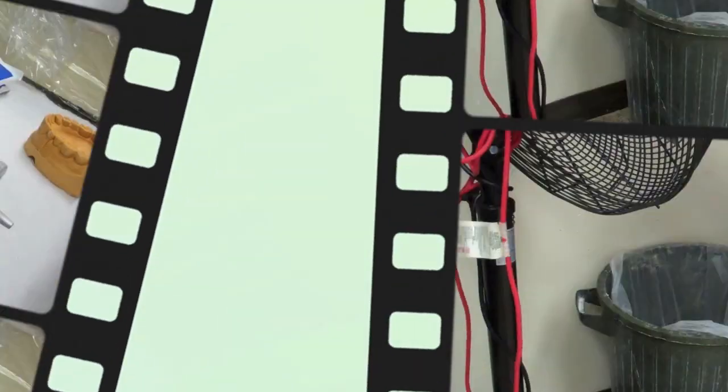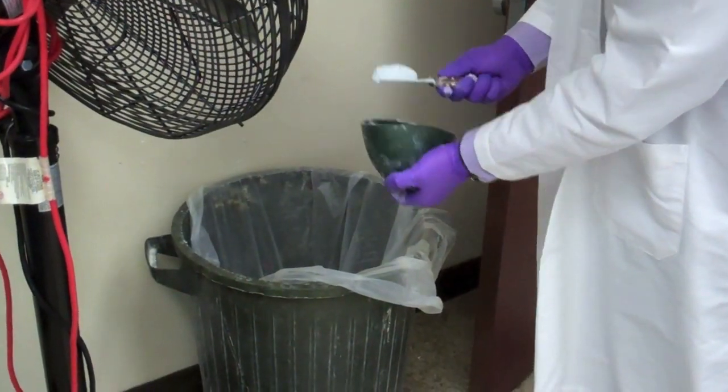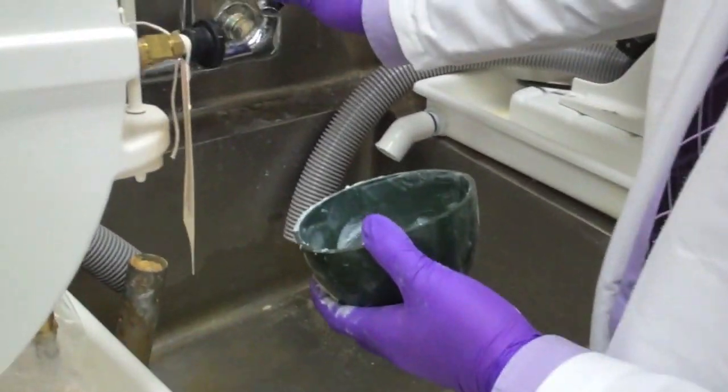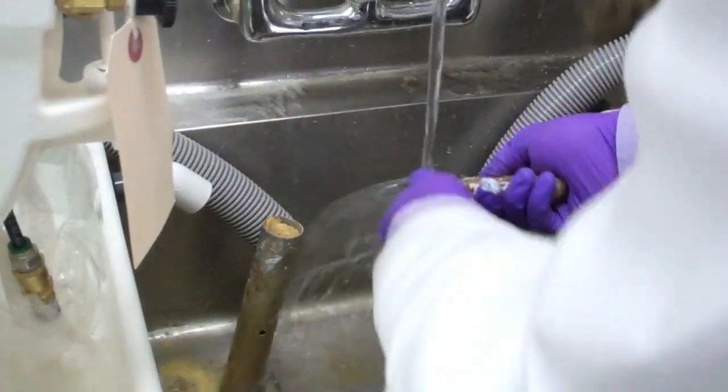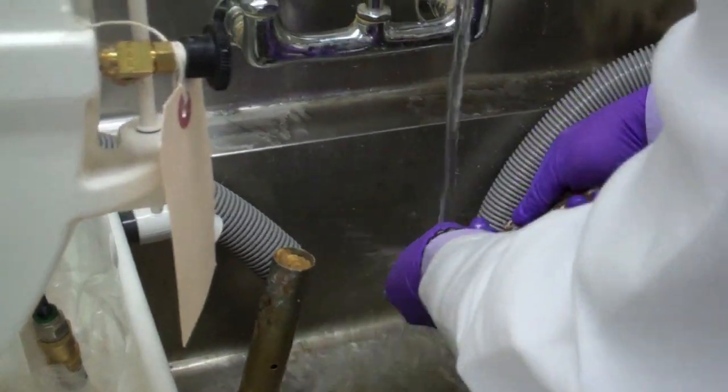Once done with this step, do not throw the residue into the sink. Throw the bulk into the garbage first. Once that is done, you may rinse out the bowl in the sink, as shown.